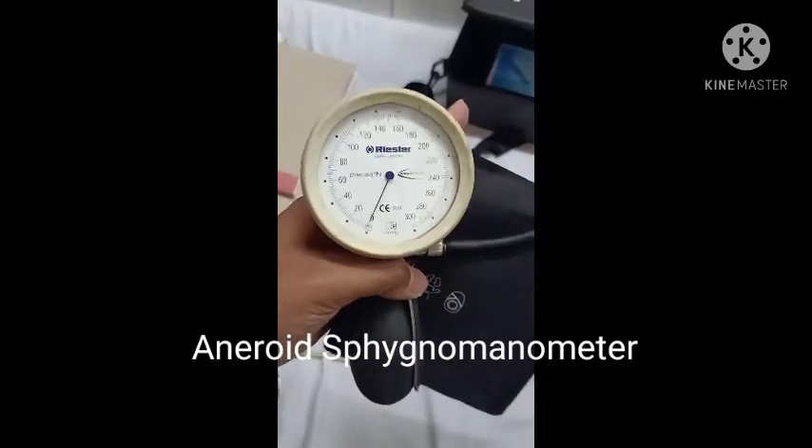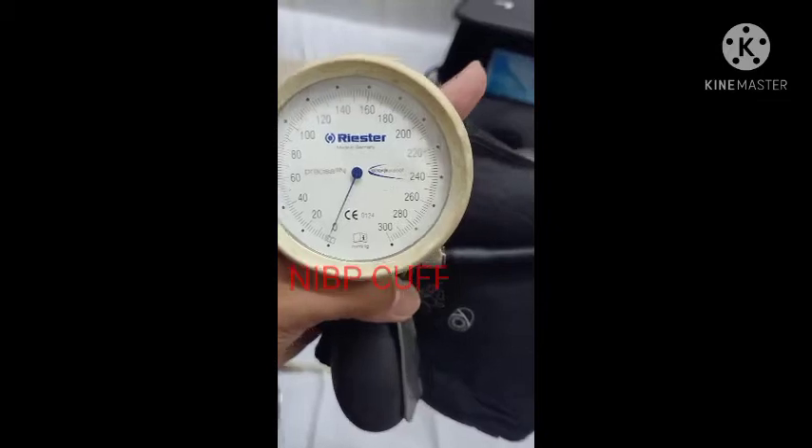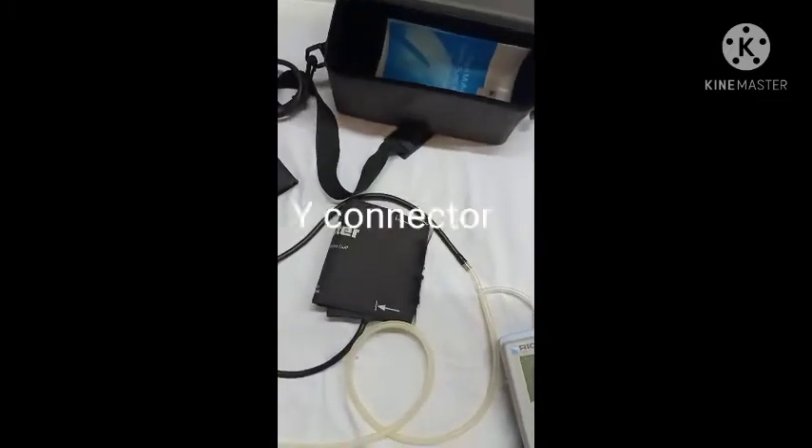Now you can see the range of the device under calibration is 0–300 mmHg and the least count is 2 mmHg. I am using Rykel Unisim Lite as a master.